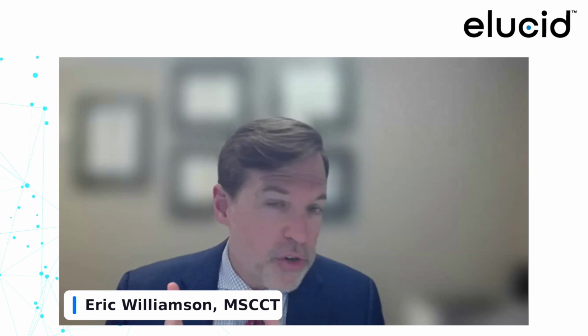Yeah, I think, Todd, we probably use a slightly different protocol. We don't use much oral in our practice because we're a radiology shop. So we're trying to get patients through pretty quickly, and what tends to work for us is IV on the table. And so we don't use oral first, not because we don't like it, but because we struggle to get it to the patient early enough for it to have an effect, right? So the patients don't spend as much time in our department as we might like them to.